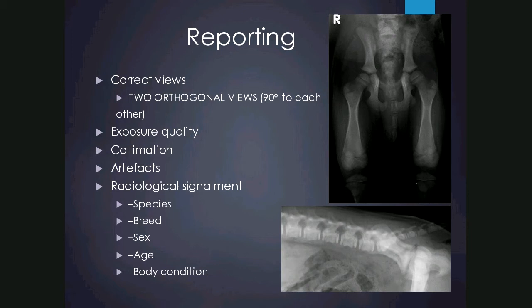For age we determine two things: whether or not the patient is skeletally mature or immature. These black radiolucent lines are the open physis, made of cartilage. In these two patients they are both skeletally immature, versus a skeletally mature patient where the physis will have disappeared.